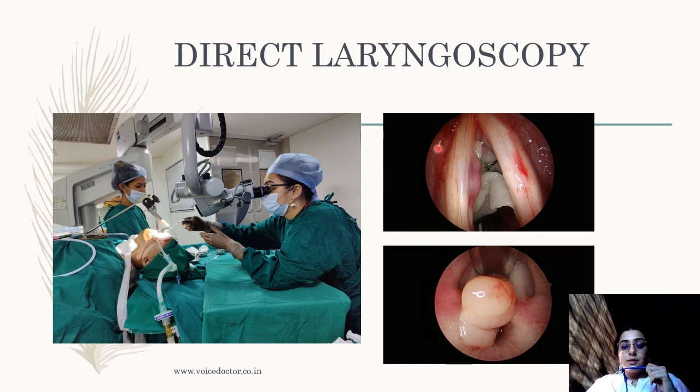So the image is far superior as compared to indirect laryngoscopy. Here you can even improve the quality. You can use the rigid scopes inside to visualize the undersurface of the anterior portion or the posterior portion. The patient is basically under anesthesia, so you can utilize the time with a lot of other equipment and try to visualize and do further things.